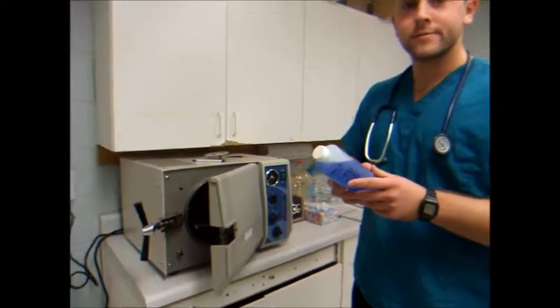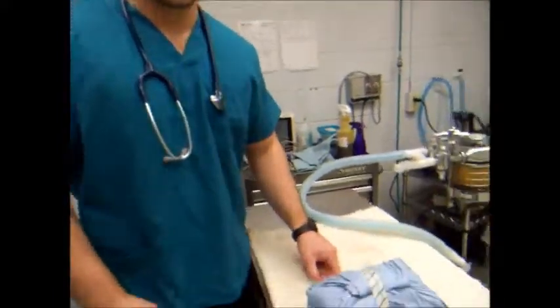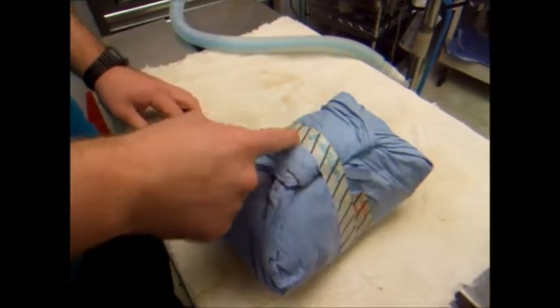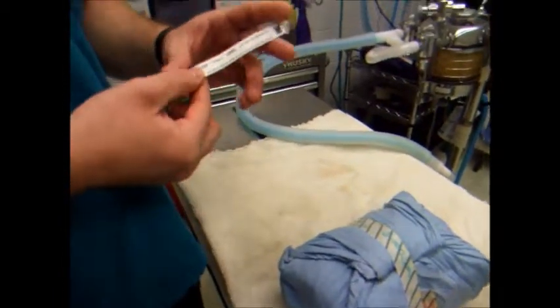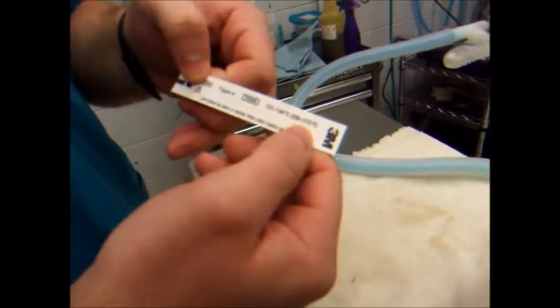And that's it. I'm going to show you how you ensure sterility in the packs. So we've got the indicator tape on top, which has the lines when it's sterile, and then inside of the actual pack we've got this strip, and this line will turn black if all the items in the pack are actually sterile.